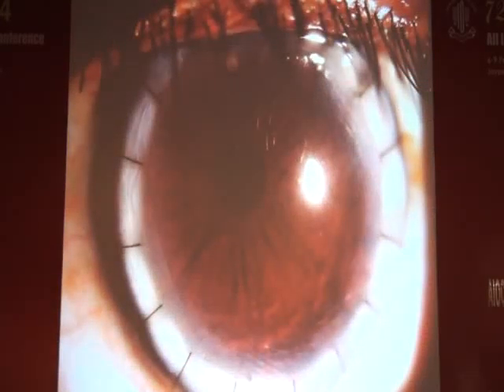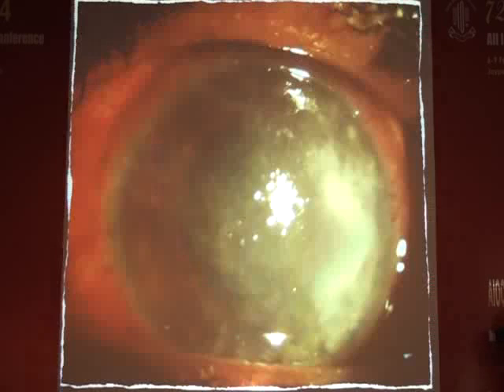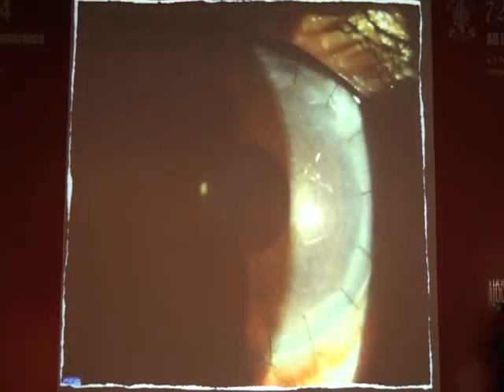So this is mostly manual, but sometimes with tectonic surgeries, as in these persons, a person with extensive TMD-related corneal thinning, which is quite peripheral, you can use a big bubble as well to do the DALK, and this is both tectonic and optical. And similarly, if you have a severe fungal infection, which is fortunately only in the stroma at this point, but going from limbus to limbus, you can use the big bubble to do a tectonic and therapeutic procedure.